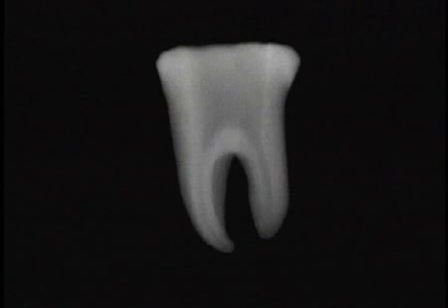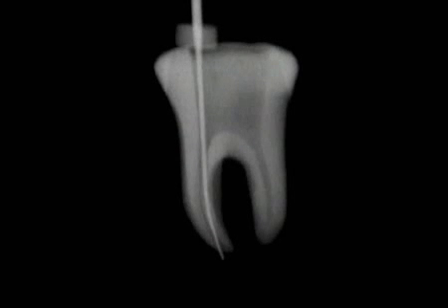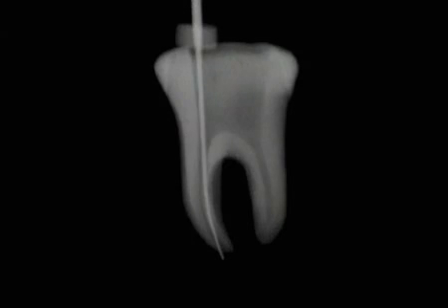Notice the mesial root's curvature and the furcal side concavity. Initially, smallest instruments negotiate the canal and follow the pathway of curvature nicely. Failure to pre-enlarge, and in addition carrying too large of files deep, drags the foramen to the outer wall and relocates it on the mesial aspect of the mesial root. This is a type 2 transportation.